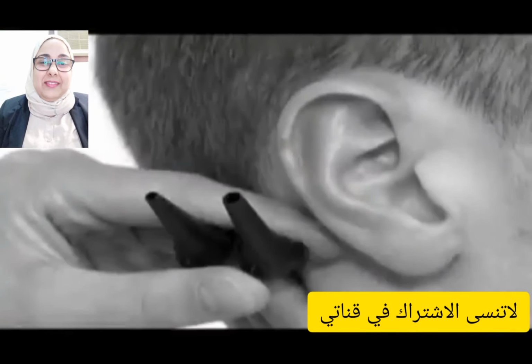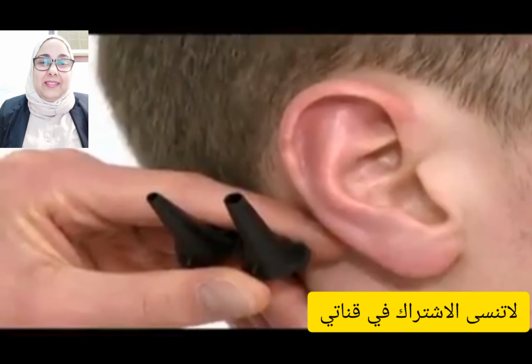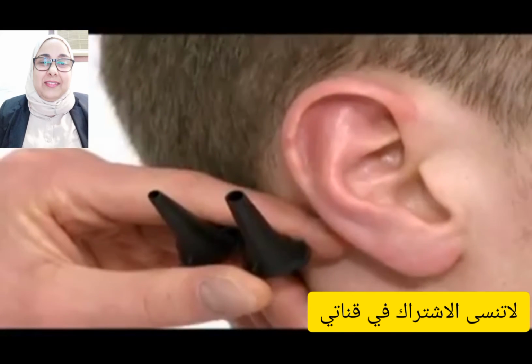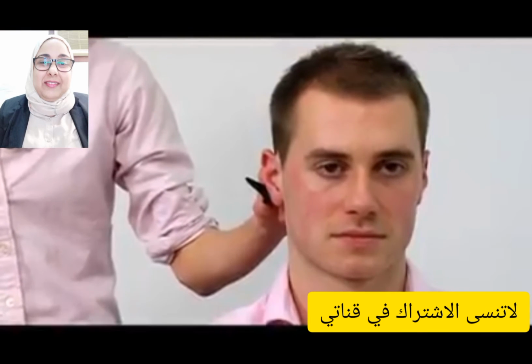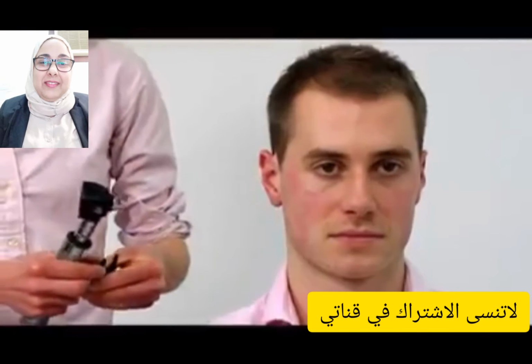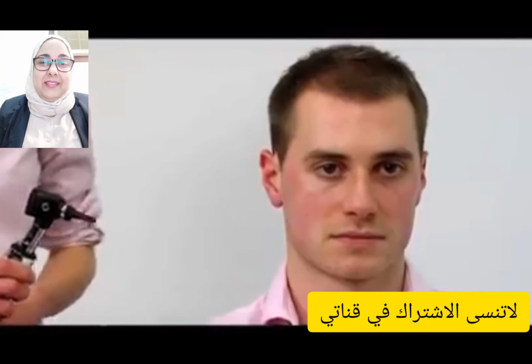Next, otoscopy is performed to visualise the external auditory meatus and the tympanic membrane. There are 2 sizes of speculum for the otoscope. Choose the largest size speculum possible for the patient's ear canal in order to maximise the amount of light passing into the ear and to maximise your view of the tympanic membrane. In adults, the largest speculum is usually used.